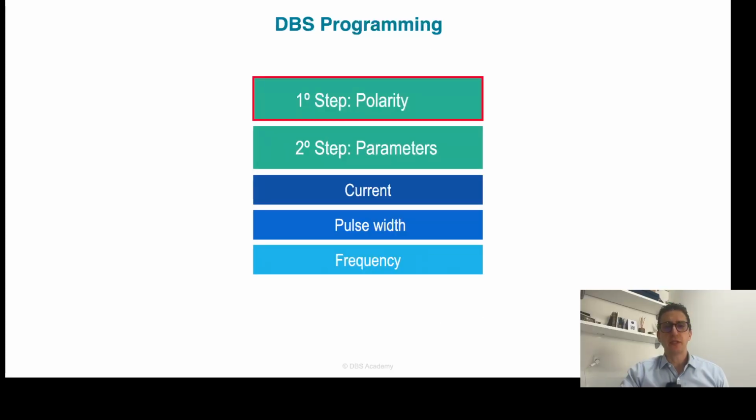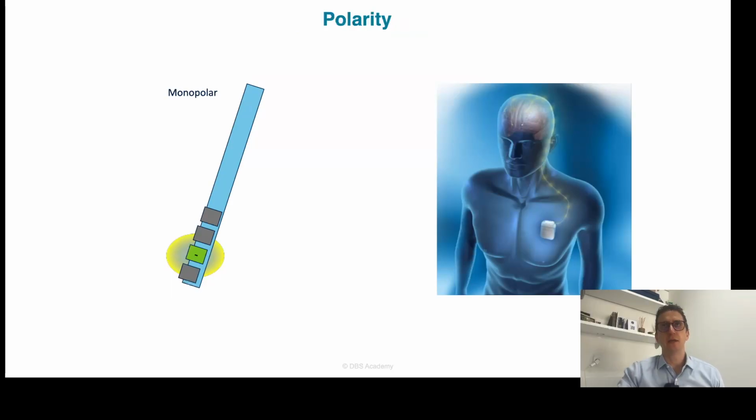So basically, when we discuss polarity, there are some concepts here. The first one is how the DBS works. So when you set the cathode here, the negative contact here, and a positive in the box of the patient, or what we overall call the neurostimulator, or the IPG, the negative ions, imagine that they are going in this direction, so away from the cathode.